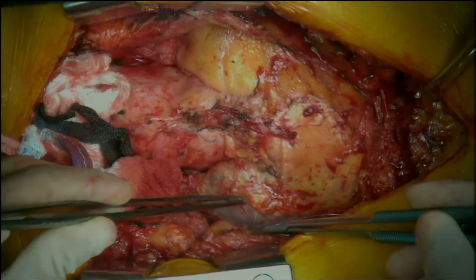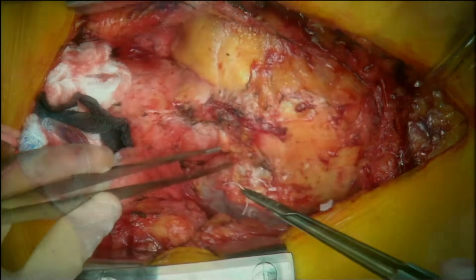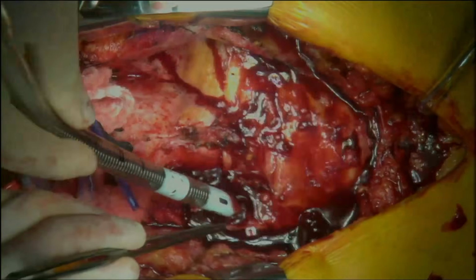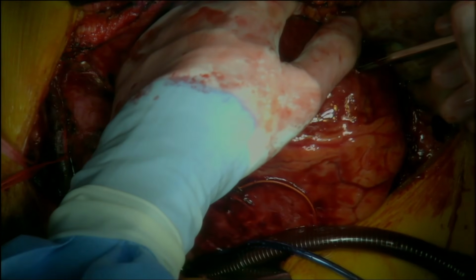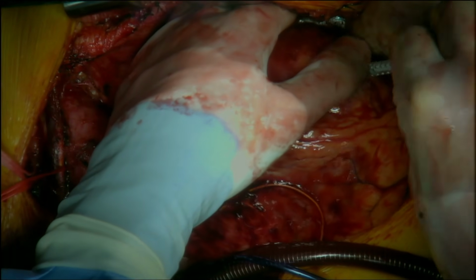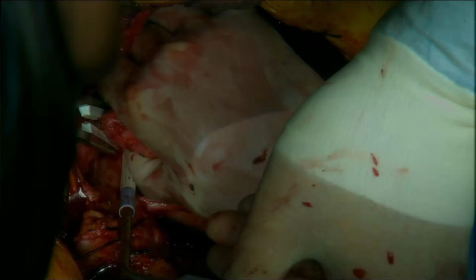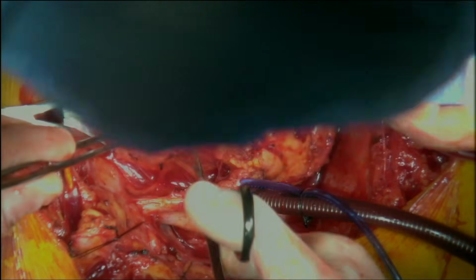Pericardial stay sutures are placed to improve exposure. The right atrium is cannulated for venous drainage. A left ventricular vent is inserted from the apex for decompression. The ascending aorta is cross-clamped, the aorta is opened, and the diseased aortic valve is exposed.